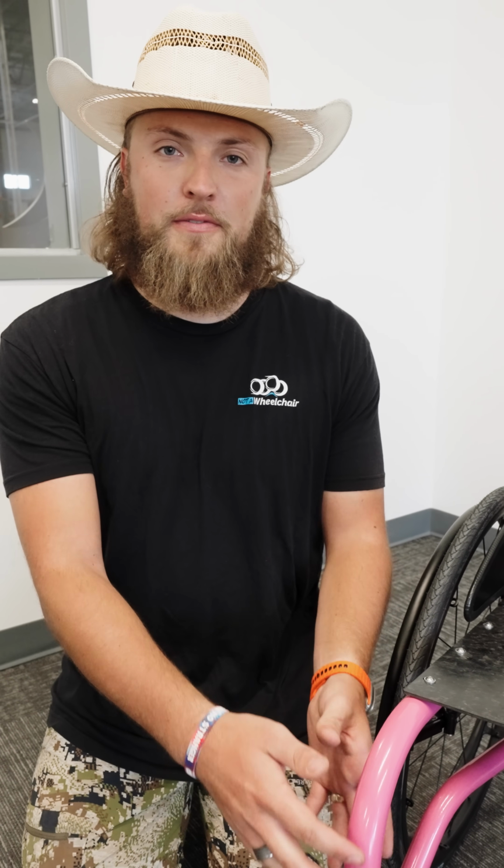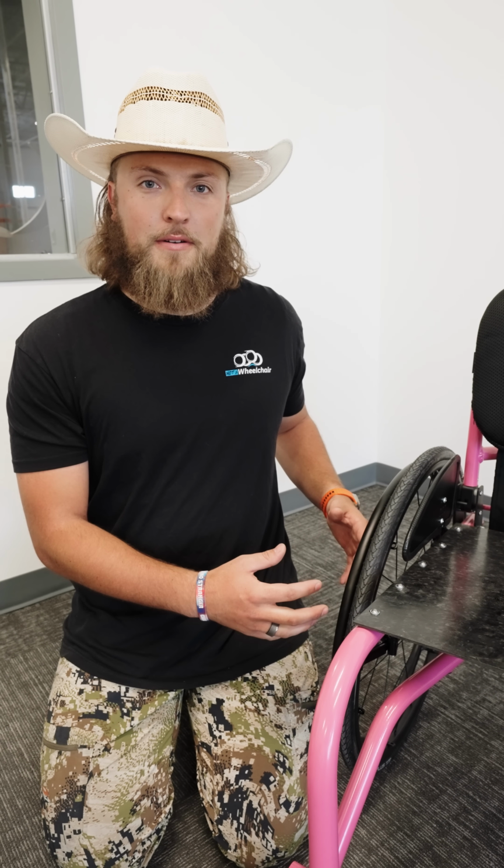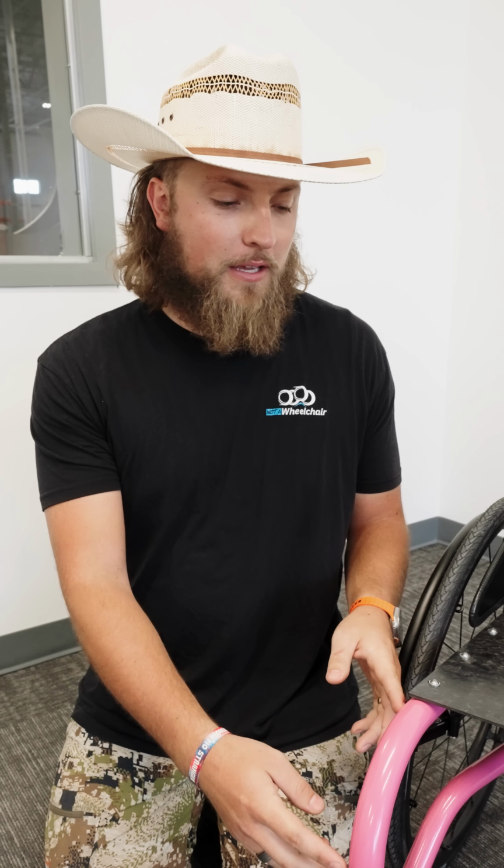The next one that we talk about is our front angle, which is the angle of the front of your wheelchair in relation to the ground. This one may be affected a little bit if you change your rear seat height or your center of gravity. But other than that, those are the measurements that can't be adjusted.